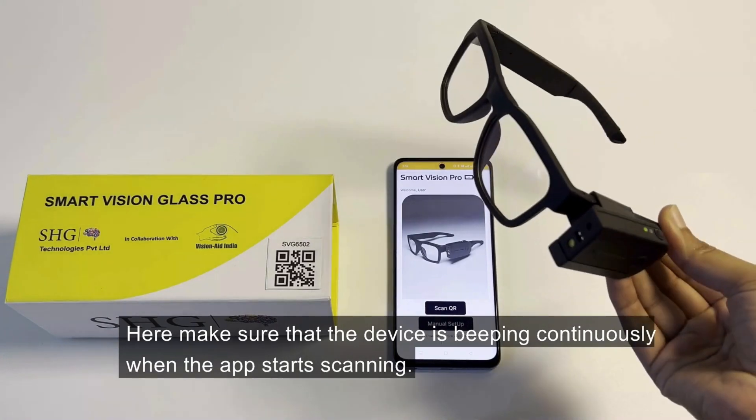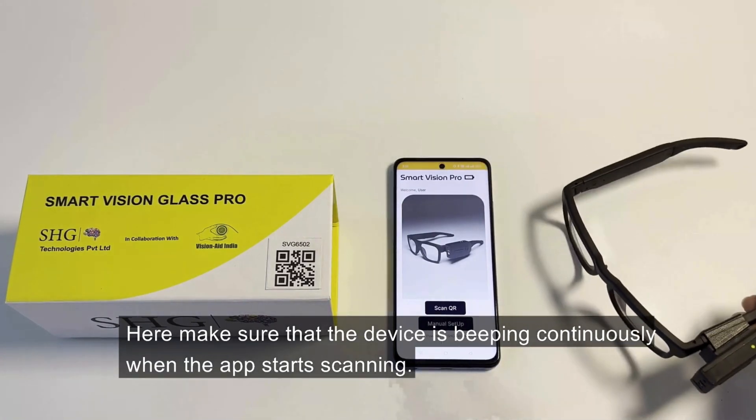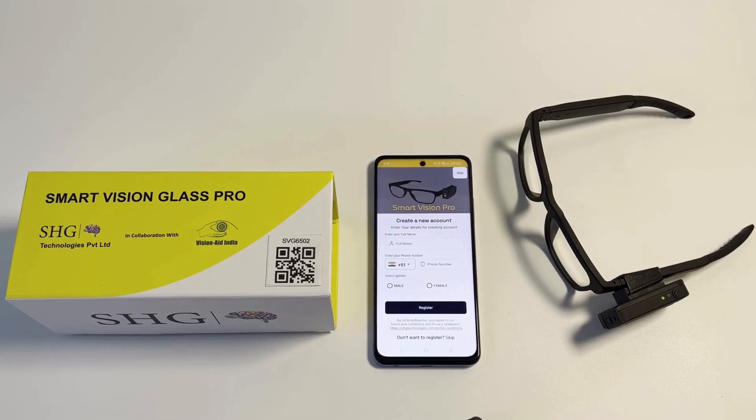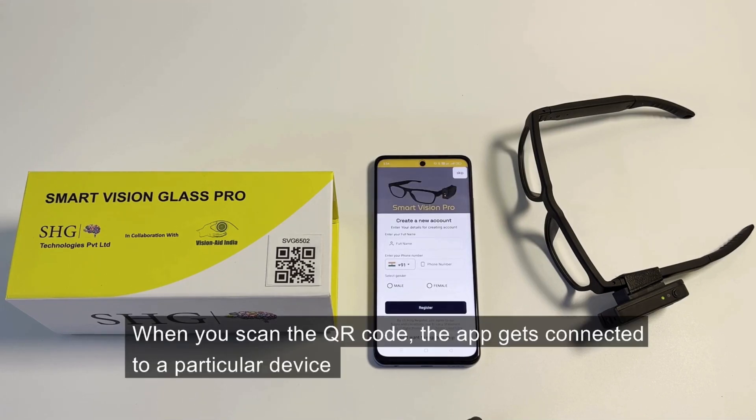You'll make sure that the device is beeping continuously when the app starts scanning. Please wait while I scan for your device. Smart Vision Glasses connected successfully. Please fill in the registration form or click on Skip to continue. When you scan the QR code, the app gets connected to a particular device.